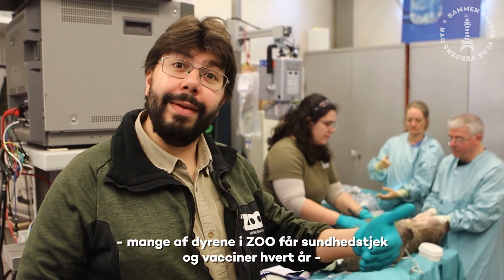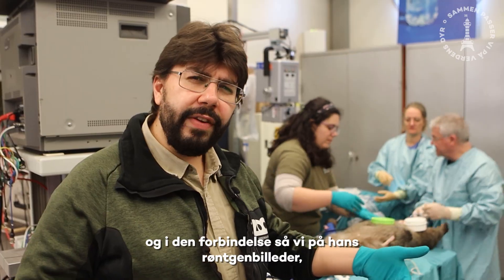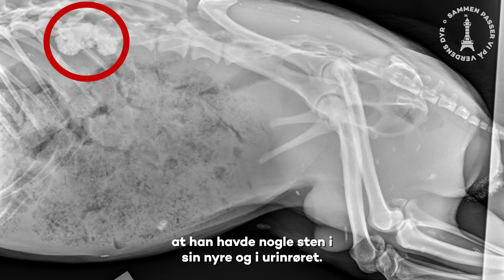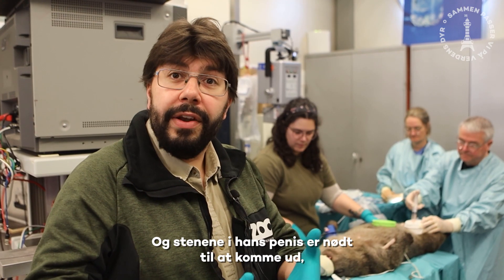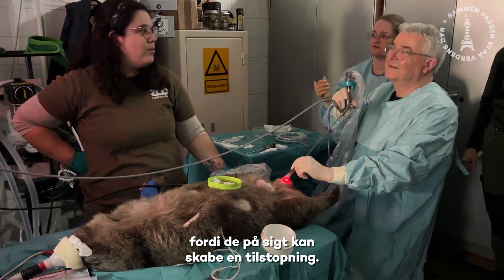Horace recently had a health check — a lot of the animals in the zoo get health checks and vaccinations each year. In the recent one we had of Horace, on the x-rays we took on this table, we found out that he had some stones in his kidney and his urethra, and the stones need to come out because we're worried that at some point these will cause a blockage.